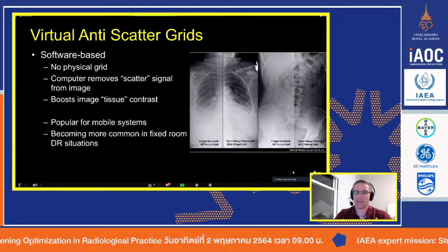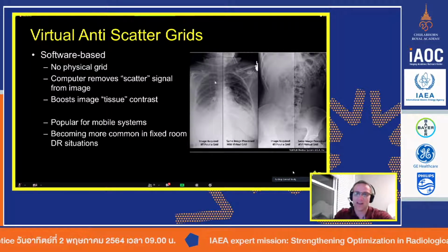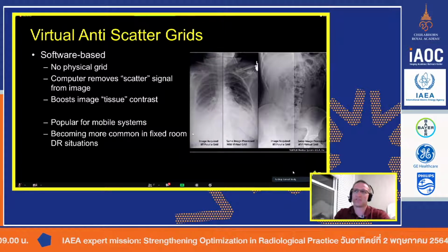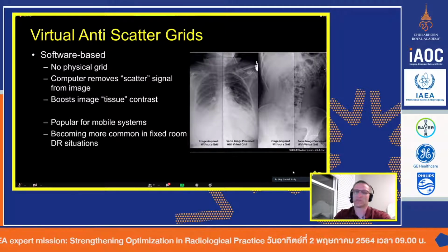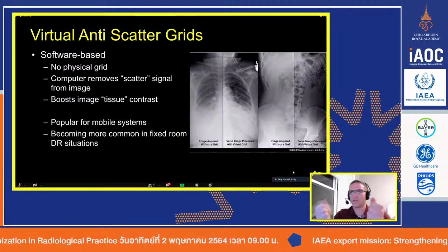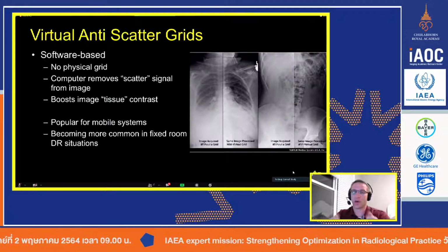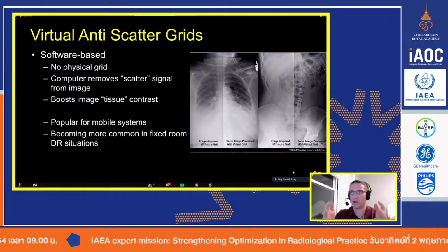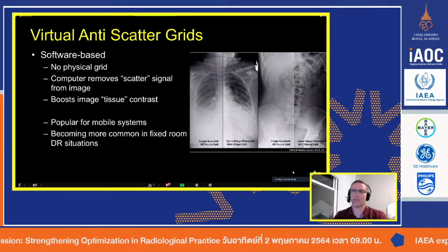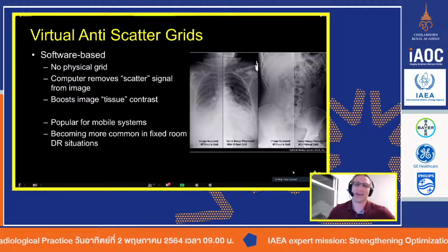But it's been my experience that they have a hard time seeing the exact line placement. Here you can't even really see. I know this image is cut in half, but imagine this white going all the way over through the stomach. Could you see where the line placement is? Would the radiologist be able to say so? So generally speaking, I hate to say it, even though those grids are real heavy, you have to use them. And if they are just not good to use, I hope the technologists can work with the hospital and the hospital can buy lighter weight ones. They are not that expensive. Now, if you have 100 mobile units, then it might get expensive. But yes.